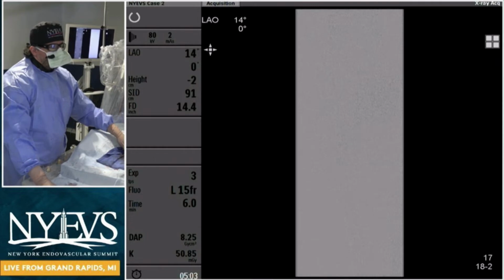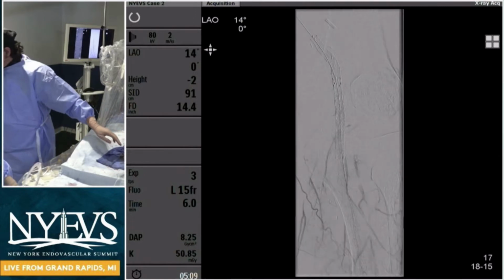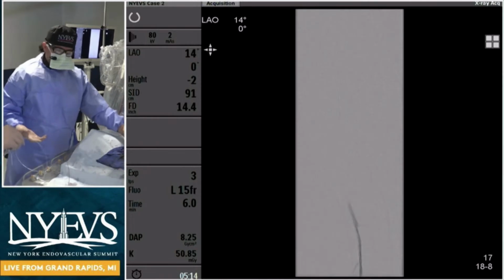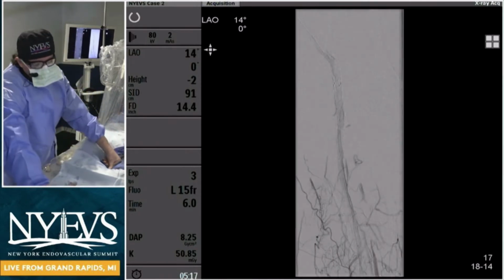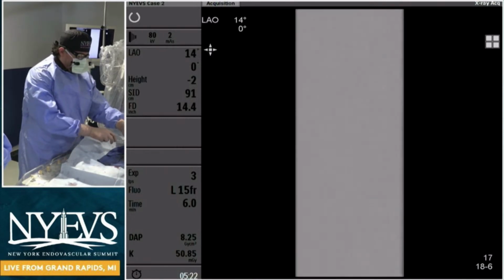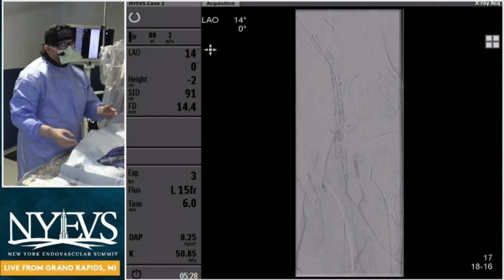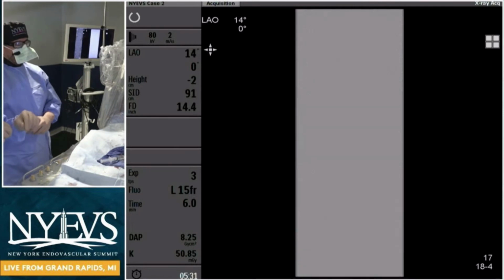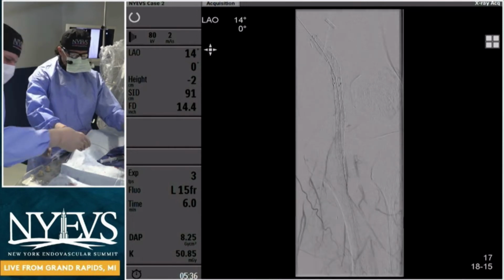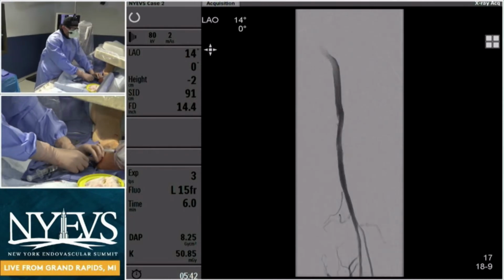We're going to go ahead and treat the posterior tibial artery next, but I want to answer. I'm going to be the first one to answer what you asked, BK. Why did I use laser? The only device that we have with a randomized trial for in-stent restenosis is the Excite ISR, testing laser atherectomy for in-stent restenosis against balloon angioplasty and showing a favorable result. Like everybody else, I've used other devices off-label, like Jetstream or directional atherectomy. They're not contraindicated, but they're definitely off-label use. So I'll be curious what other panel members want to use.